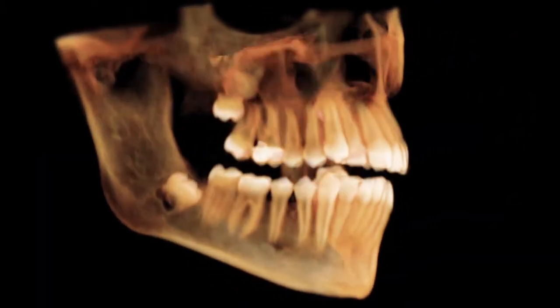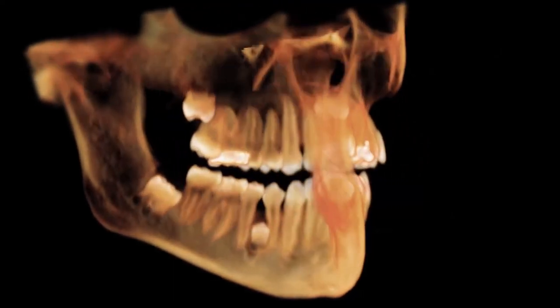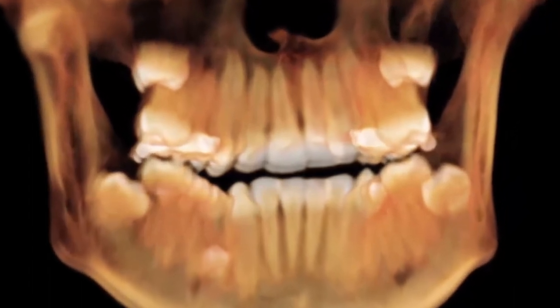It is the basic cephalometric view, often used by orthodontists and radiology centers, but can also be useful for cosmetic and general practitioners due to its comprehensive size.